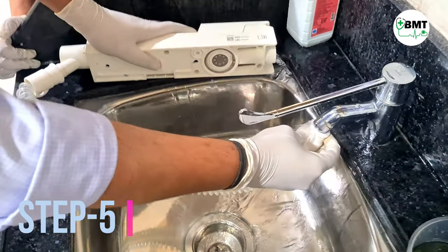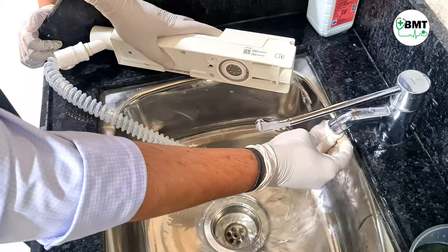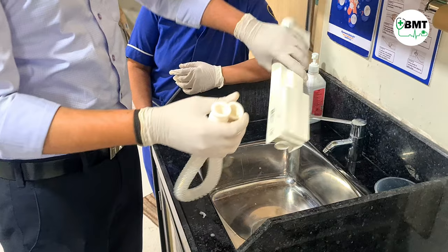Step 5. After this, remove all cidex solution and rinse the cassette through water 2-3 times to remove the leftover cidex solution residue.